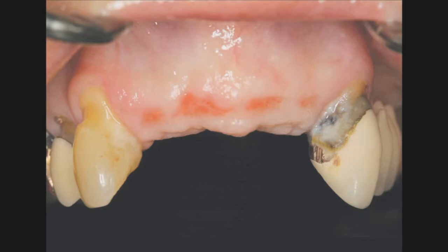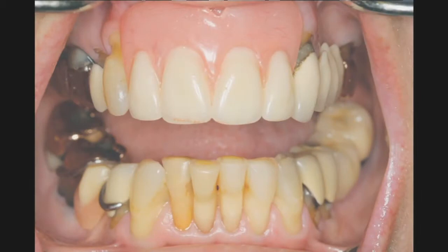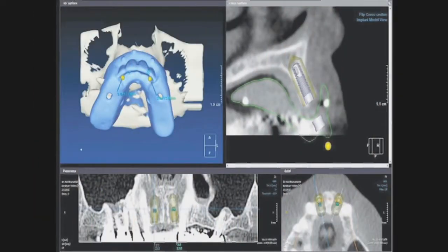The patient lost these teeth following a very bad fall. She was wearing a flipper-type appliance for over 8 months when she came to the practice. Her quality of life was remarkably diminished, and she requested permanent, fixed restorations. Anterior aesthetics can be a challenge for the best of us.